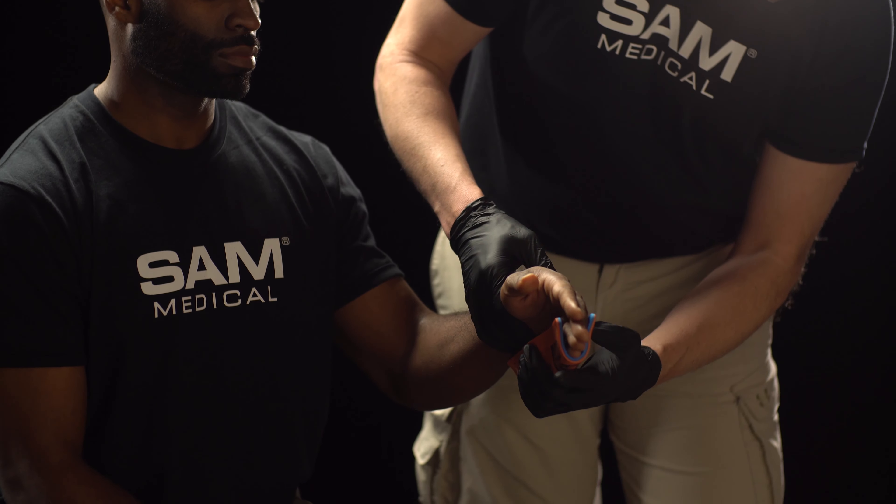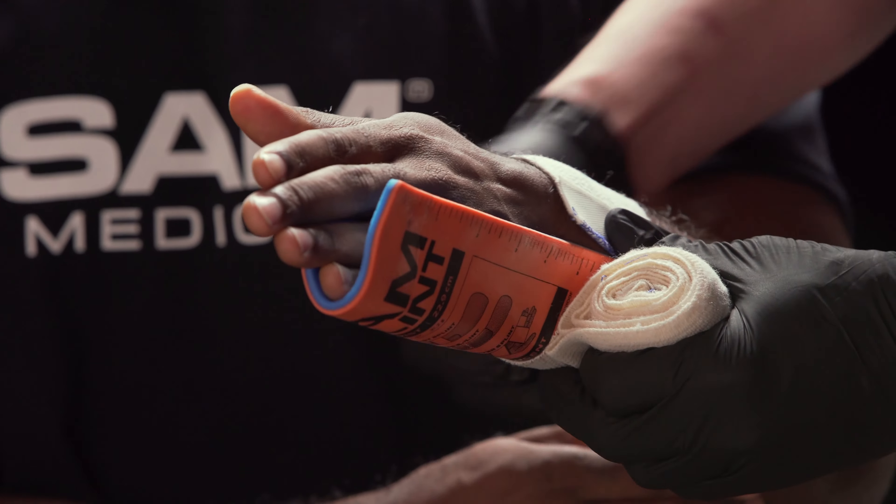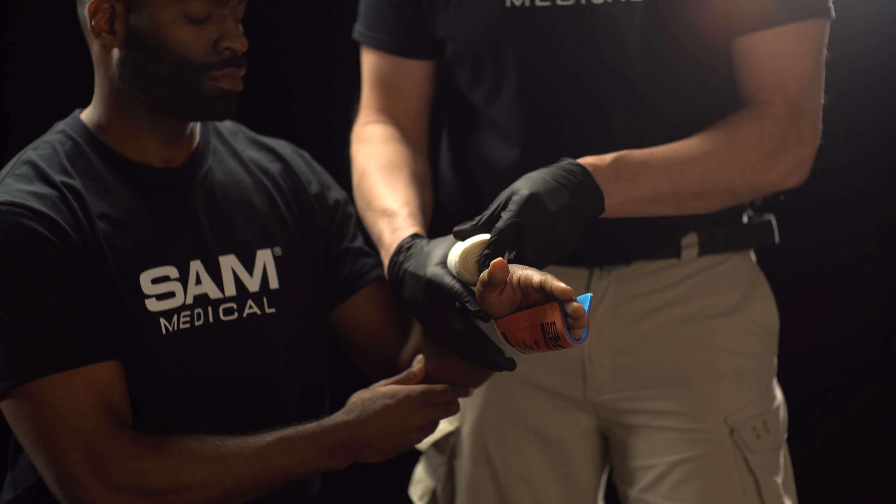Apply Sam Splint to the patient's arm and wrist. Make fine adjustments and secure Sam Splint with wrap of choice.